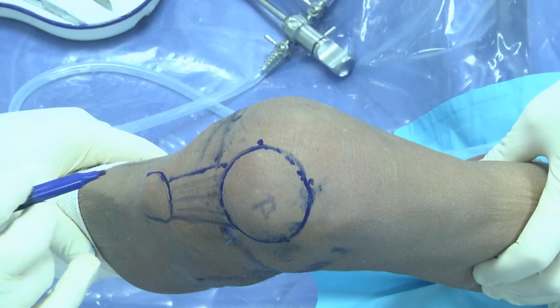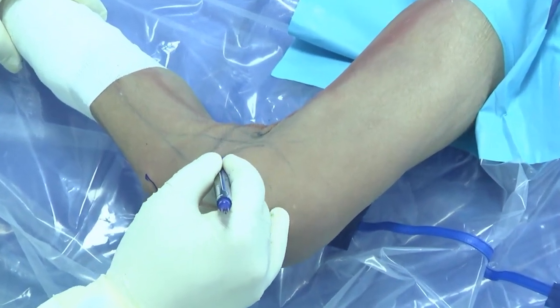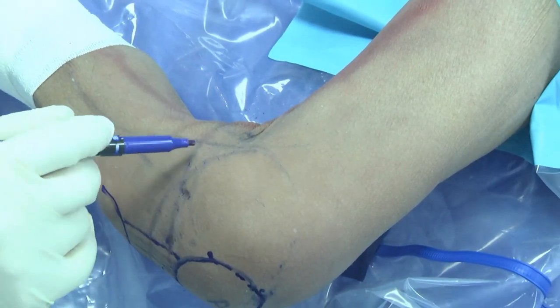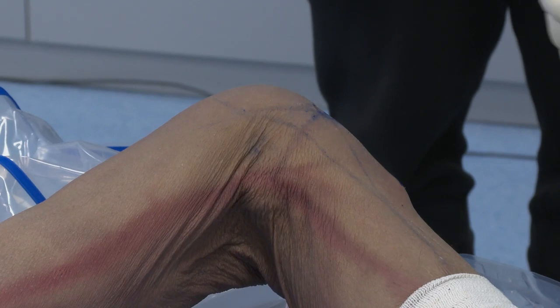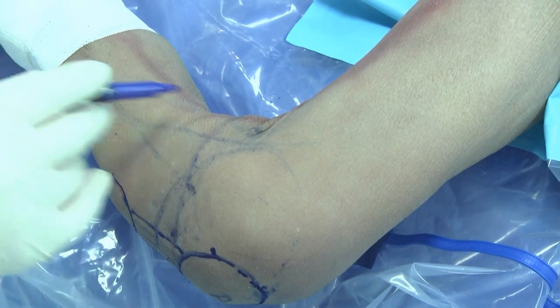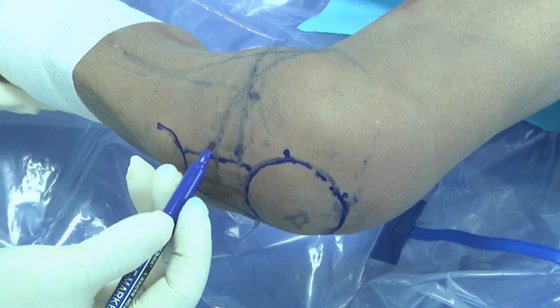Can you see well? Would you flip the knee a little bit like this? Okay, good. So this is the saphenous nerve, and it will go this way. The saphenous nerve has a course with some variations and branches. Another branch goes to this side. We call this the infrapatellar branch of the saphenous nerve. Another branch is the sartorial branch of the saphenous nerve. So if you harvest the graft too high, or you make the incision vertical, you will cut the nerve.